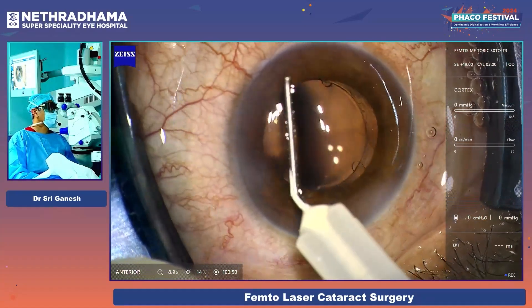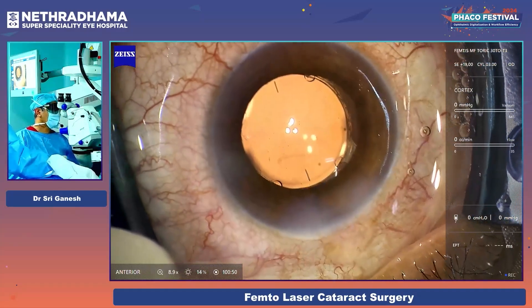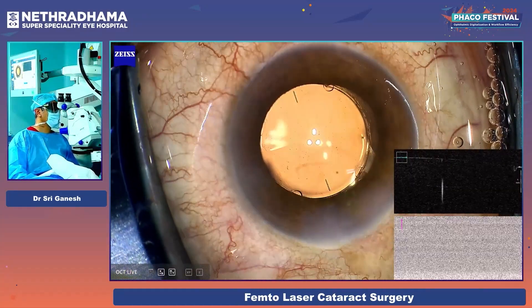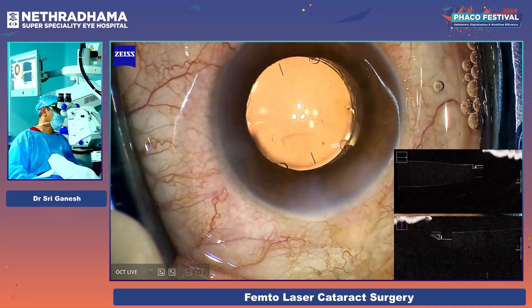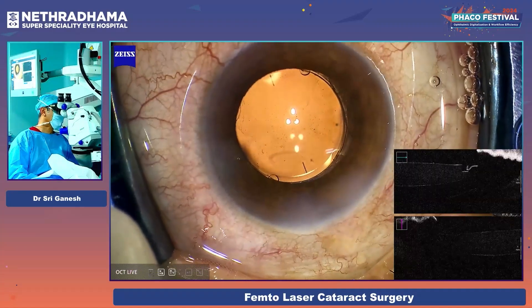You can see that now the chamber is formed. I will put on the OCT to show you the position. Can you see the enclavation there in the capsulotomy? You can see the lens and the enclavation in the capsulotomy.